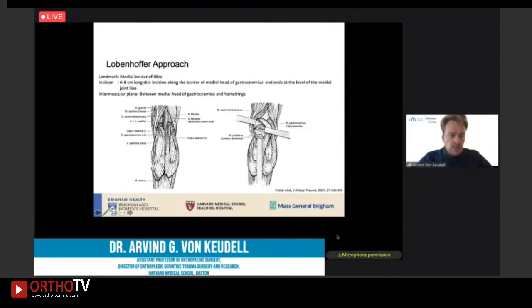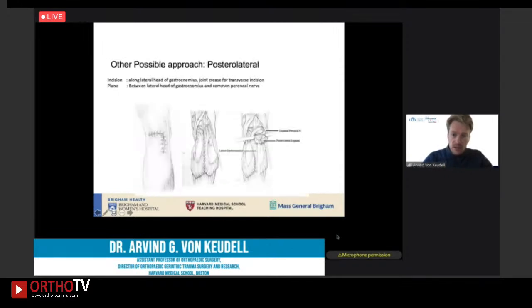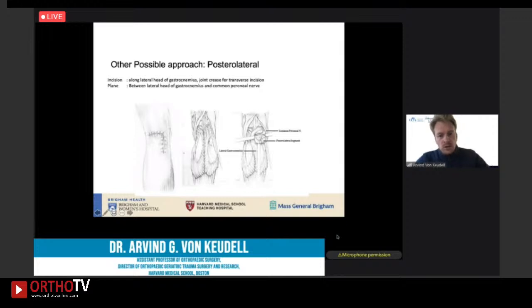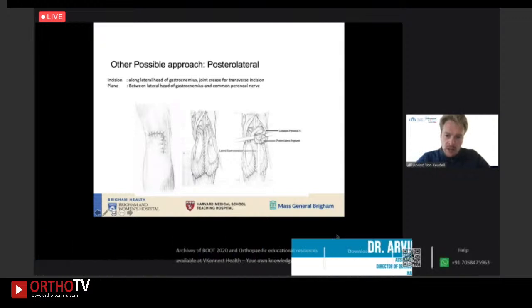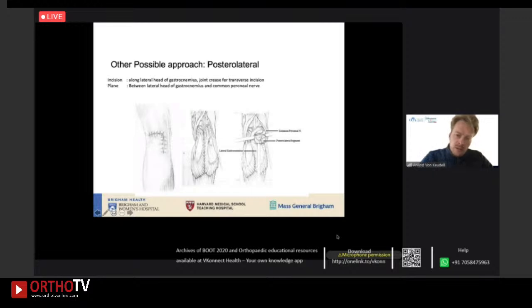The Lobenhofer approach is essentially similar to the posterior medial approach. In the prone position, you find the medial border of the tibia and make about a 6 to 8 centimeter incision along the medial head of the gastrocnemius, then dissect down to the fascia. On the posterior lateral side, you go around the lateral head of the gastrocnemius. You must find the common peroneal nerve to protect it. In cases where the main fracture line is right behind the fibular head, you can also employ a fibular osteotomy.